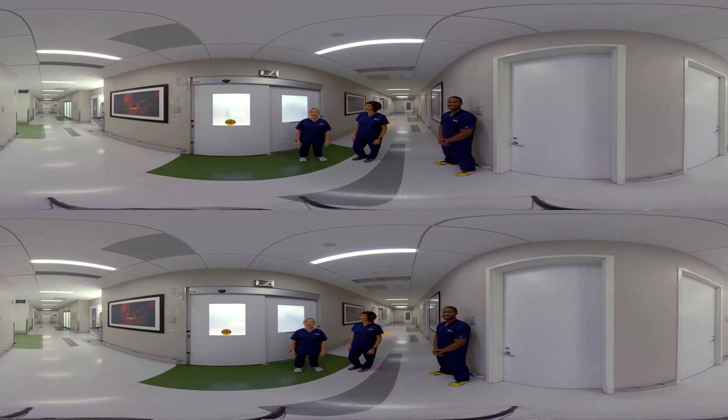Hi, everyone. Thanks for joining us today. My name is Emily, and this is a virtual reality 360 experience for the Arctic Sun 5000 temperature management system. Today, we're going to show you how to deliver targeted temperature management for neonatal, pediatric, and adult patients.